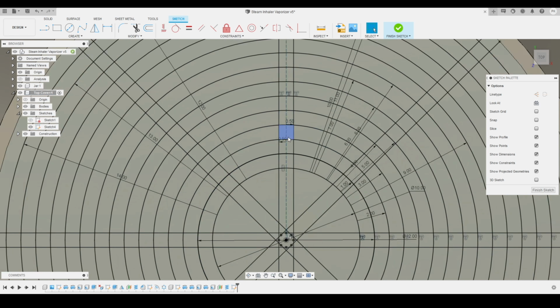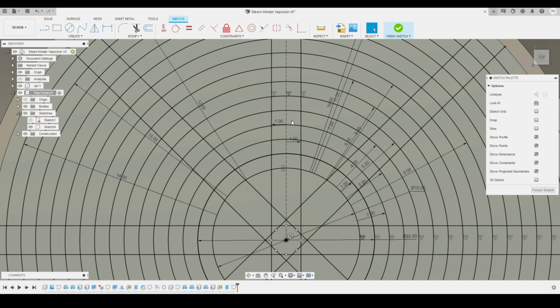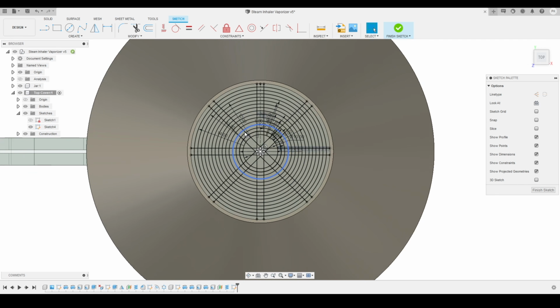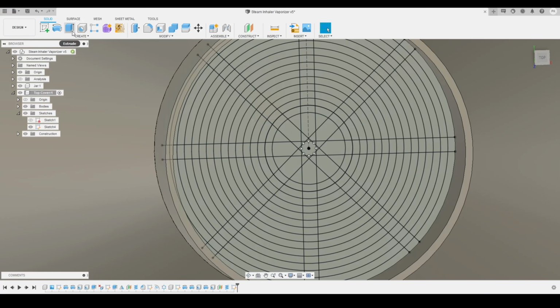So here you can see this is my result. This is what we got, and I can change this offset distance if I want. I can increase or decrease it. So I just increase it by 1 millimeter on both sides. Here you can see, and we click on finish sketch. So this is the profile we got.